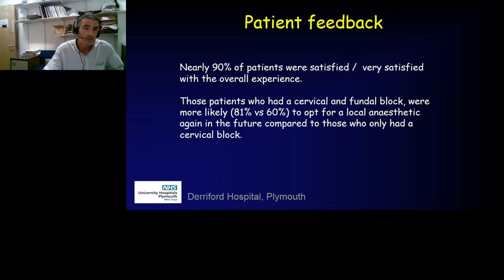And there was quite a significant difference once we introduced the fundal block. Initially, without the fundal block, we found that maybe 60% were finding it a reasonably good experience, but this increased significantly up to 81% once that fundal block was introduced. So if you are starting this in your own setting, then I'd really commend that Williams needle and the fundal block for your patients, which is an easy technique to learn.